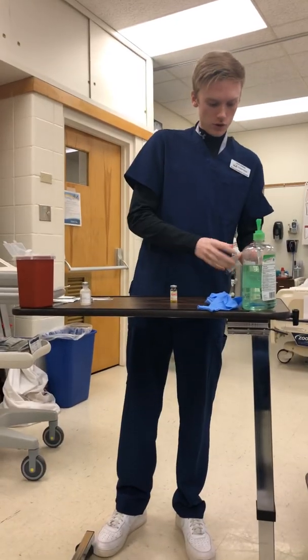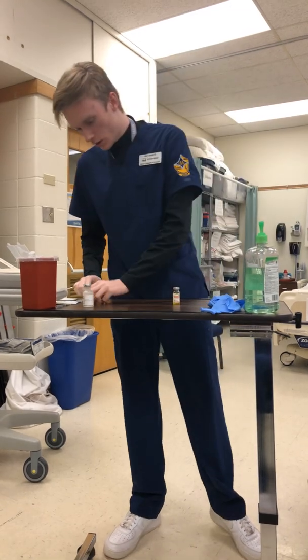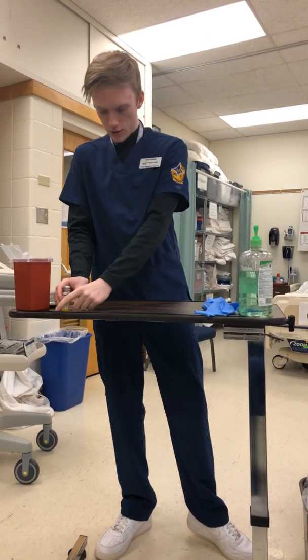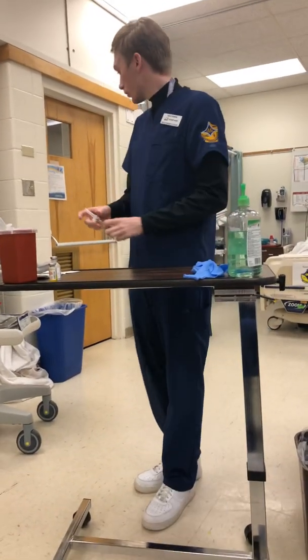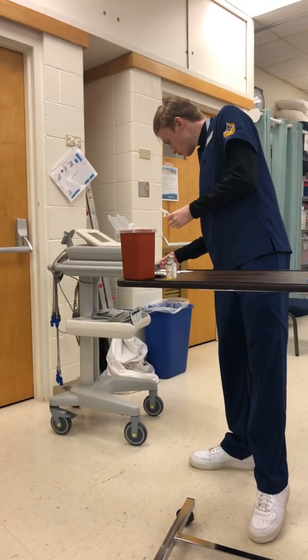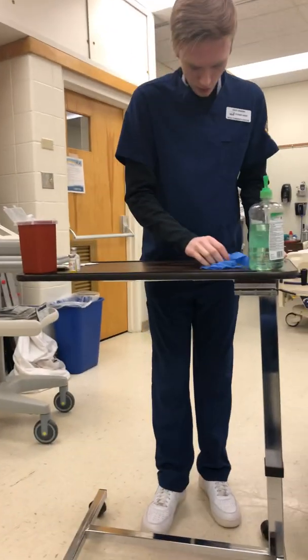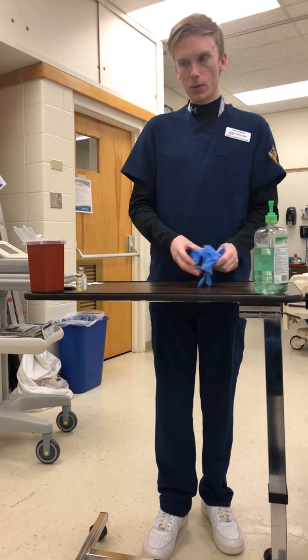We'll introduce ourselves to the patient and go from there. Clean up my area before I go and return the medications to where I got them. And this is where I would perform my second check to make sure that our dosages match, which they do. We still have the 6 rights that we are meeting still, right patient. And now we are ready to head to the patient's room.